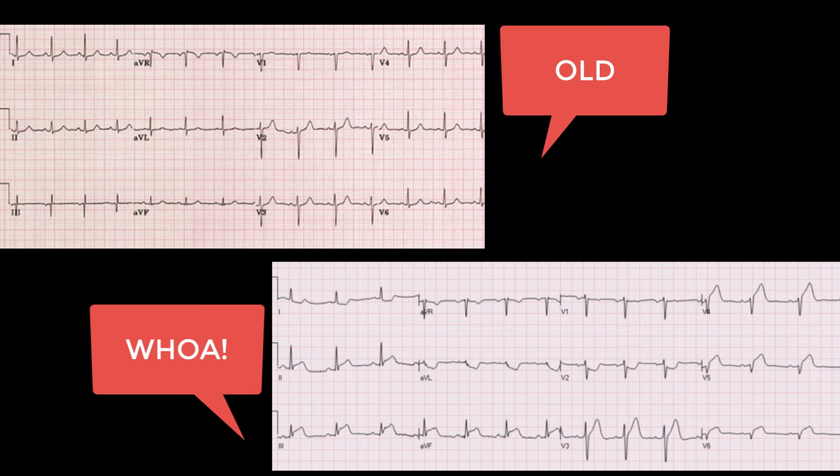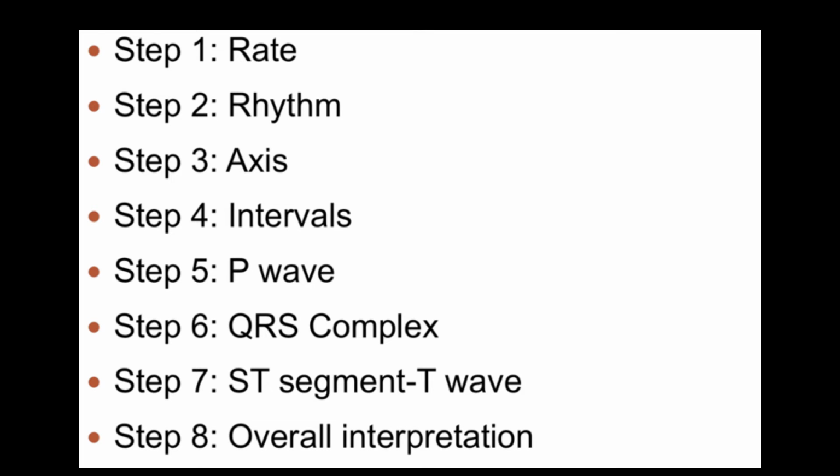Reading an EKG can be intimidating at first, but the key is to really form a systematic approach that works best for you. A lot of people teach different ways of approaching this, and hopefully with our approach here, you'll build off of that, and hopefully it works for you as a basic approach. This is going to be an approximately 8-step process to reading an EKG. I'll run through the steps really quick and then we'll go into more detail.